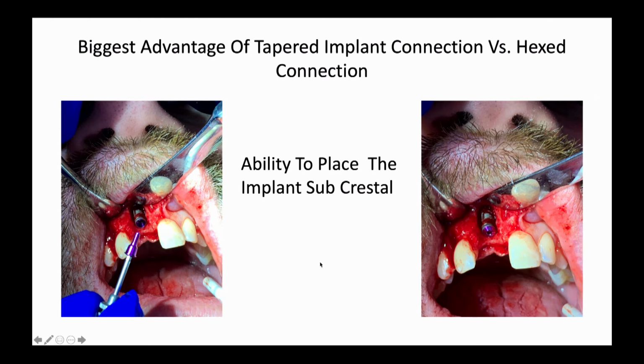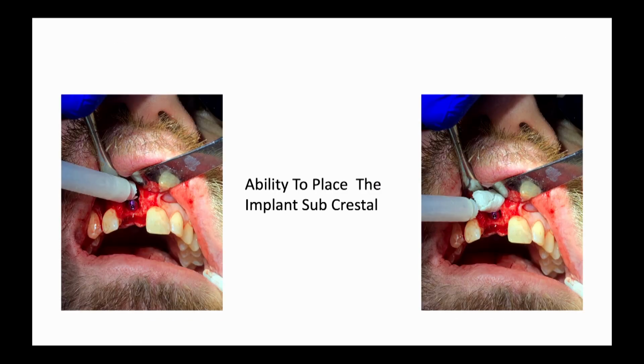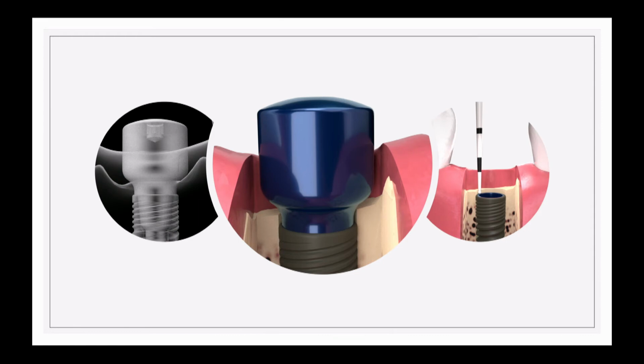It's pretty common that you run into some buccal bone loss or all the buccal bone loss extracting some of these anterior teeth. So it's pretty rare now that if I can stabilize the implant, orient it correctly, and get it behind the buccal plate, I'm not going to do all that today in one appointment. It's very predictable with the fairly predictable grafting techniques. So graft would go on top of that, a barrier to close it up and give it the appropriate time for that case to heal. Pretty typical in practice today.